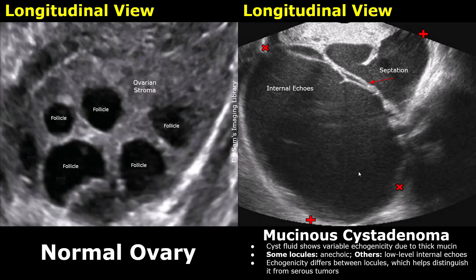Mucinous cystadenomas are composed of multiple locules, and each locule may contain mucin of different viscosity and concentration. Because ultrasound echogenicity depends on how sound waves interact with the internal contents, these differences in mucin consistency lead to different ultrasound appearances in adjacent locules.